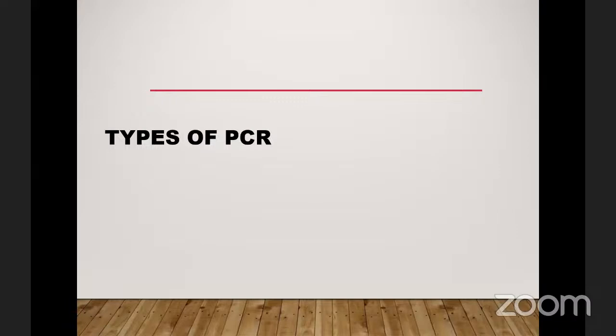We are only interested in targeted areas in the DNA that will help us to make diagnosis, right? So for instance, there's a mutation in so and so gene in a person. You target that region in that part of the human DNA, and then you are able to establish that there is a mutation. So you do targeted amplification and make several copies of that particular target. So that's what PCR does.